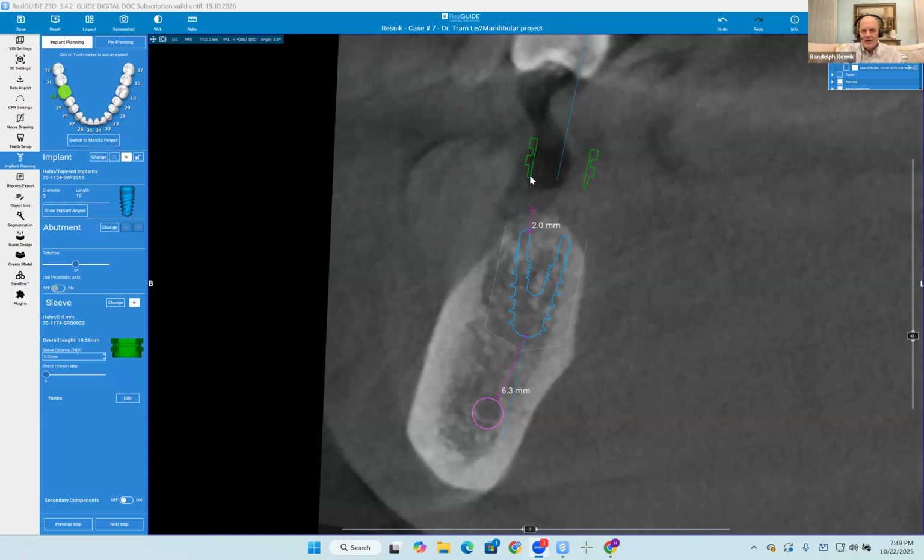Hussein, can you show her how to decorticate into that buccal bone, like mid-implant on the facial? Right, right in there. Just decorticate that area and go ahead and graft it, and I think you'll be fine. Just graft it and put a membrane over it, because it will be a wall defect. So it'll be like a catcher's mitt. Graft it, just put a small piece of regular collagen, and then just close it up. You're good.